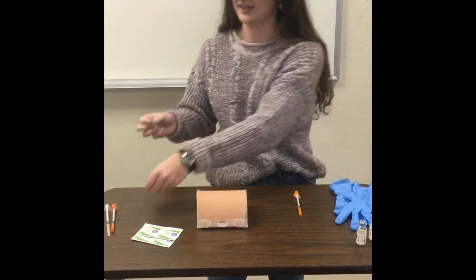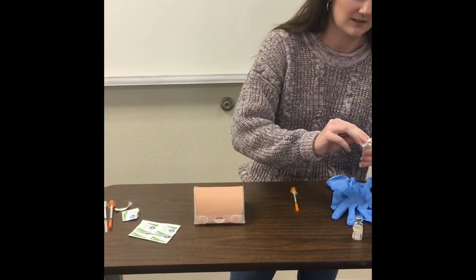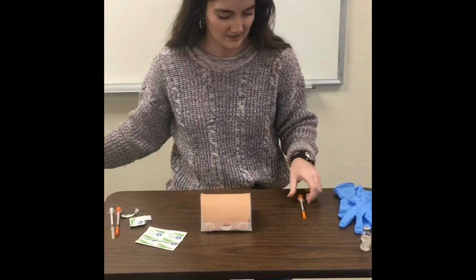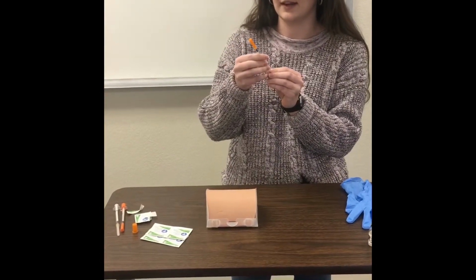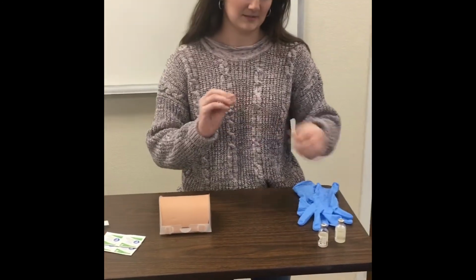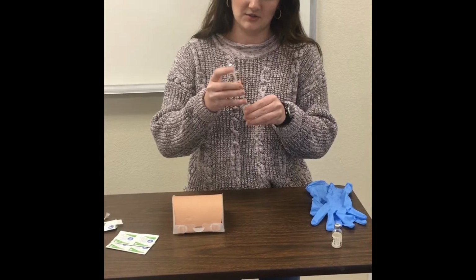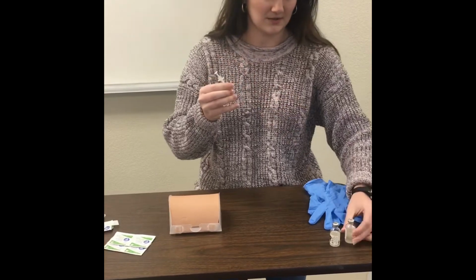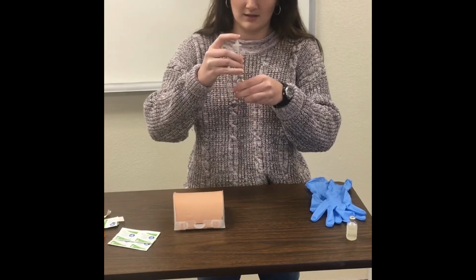I'm going to get an alcohol prep pad to clean my vials. So rub that, and let that dry. Since our order was for 5 units, we're going to draw 5 units of air. Then we're going to go cloudy, clear, clear, cloudy. So we're going to go into the cloudy NPH first and inject 2 units of air. Then we're going to go into the clear and inject 3 units of air.